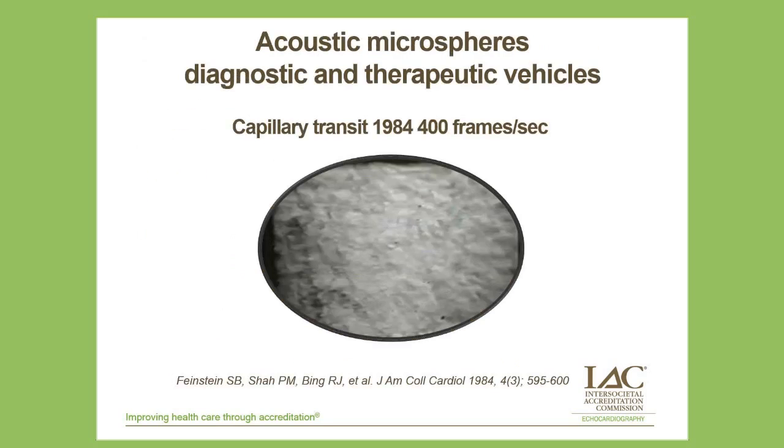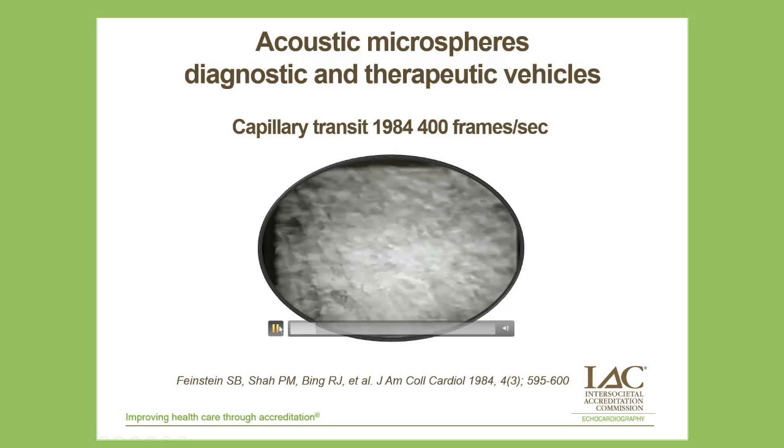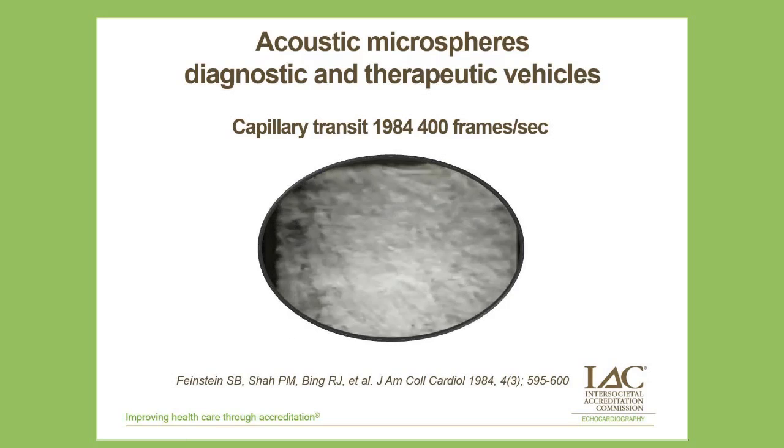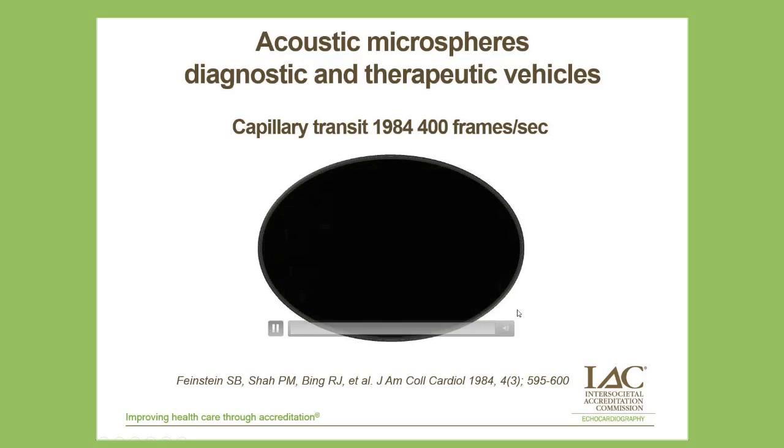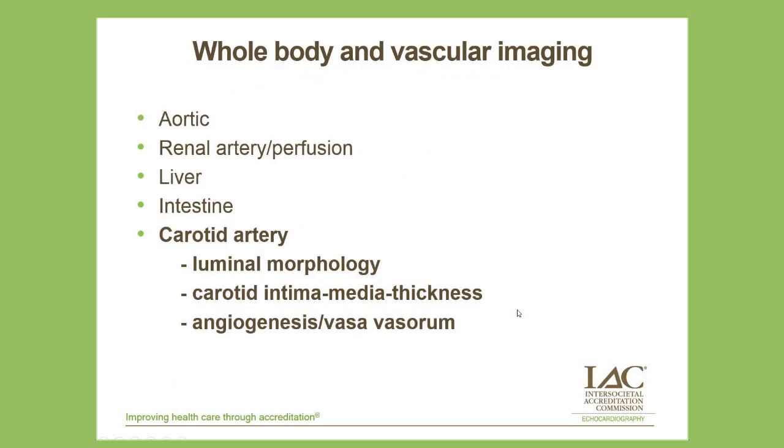When we look at the ultrasound microspheres, the biggest issue is, do they pass through the capillary vessels? Well, this was an image from 1984 in an intravital microscope looking at sonicated renographin in a capillary. And sure enough, as you will see now, the micro bubble or microsphere passes readily through the capillary, as do all the contrast agents today, and are not trapped in the capillary vessels.